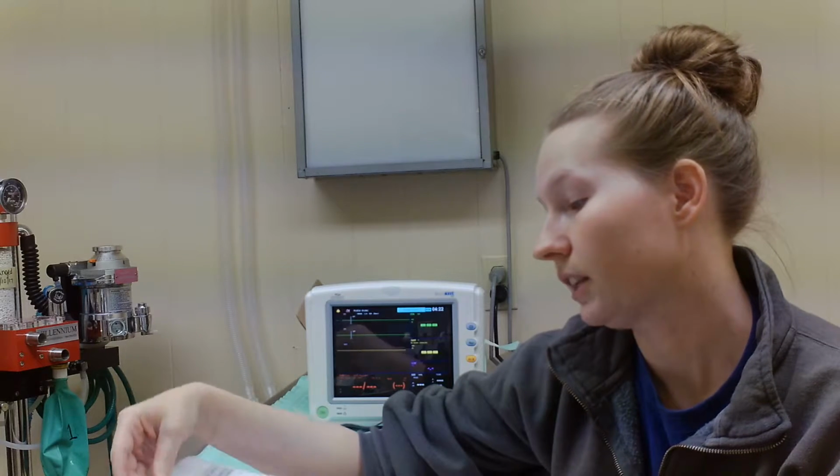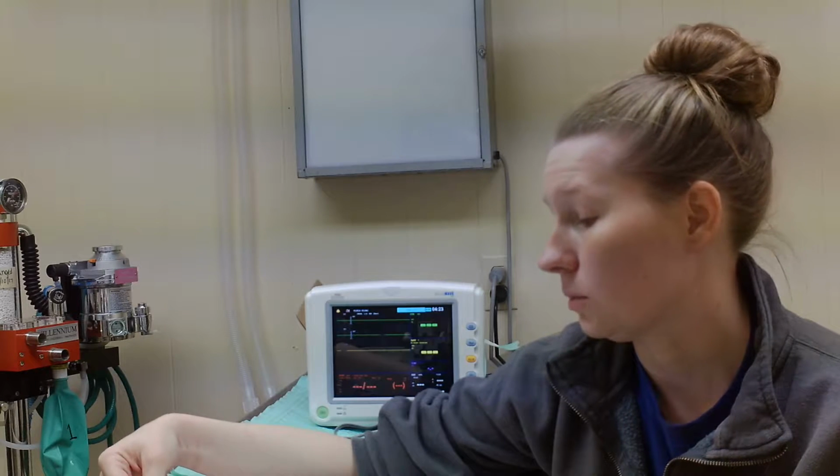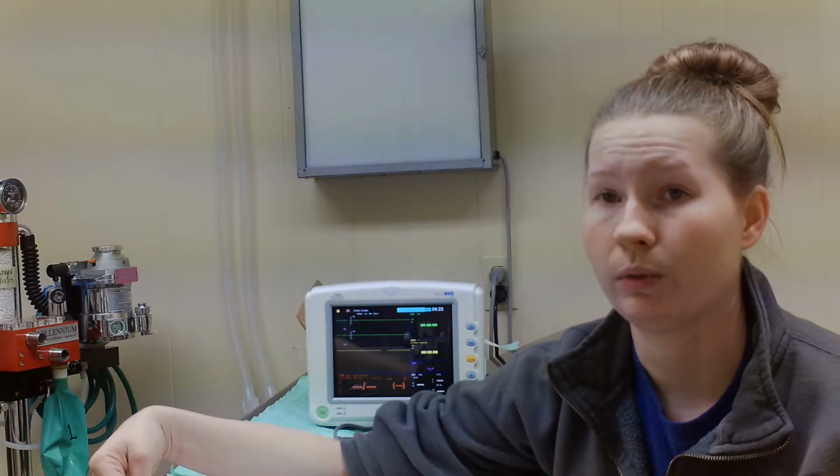Respiratory rhythm: normal inhale, exhale, inhale, exhale. Like the sinus rhythm is normal. Anything that's kind of shallow, where the patient's not able to get the proper oxygen flow through their blood and through the rest of their body, that's not normal. We want to know what's going on. Why are they not breathing properly? Does it hurt? Is there fluid on their lungs? Is there fluid around their heart? What's going on with that? So that's another reason why it's important to know normal respiratory rhythm and respiratory rate.